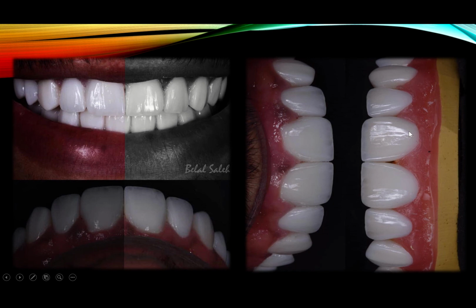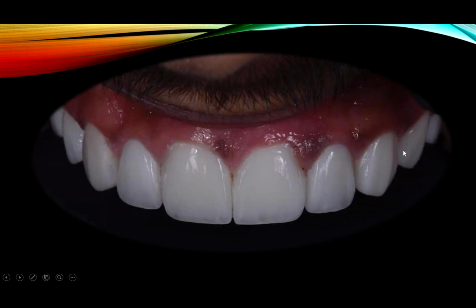But if you need to, yes, you can grind down to 0.3, 0.2 if you're very careful, and you can apply whatever dentine or deep dentine or cervical mixed with dentine in this area. You can intensify the dentine in this area. You can do whatever you want, but I suggest that you start with monolithic.